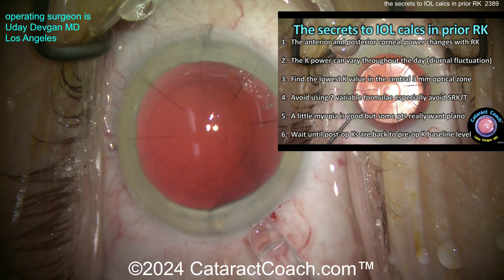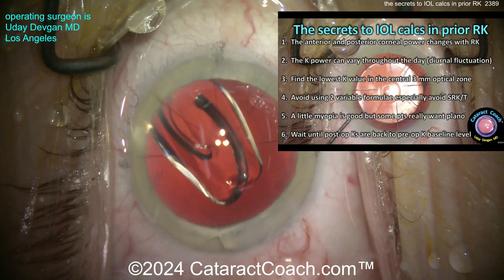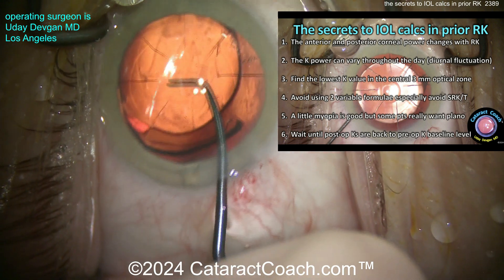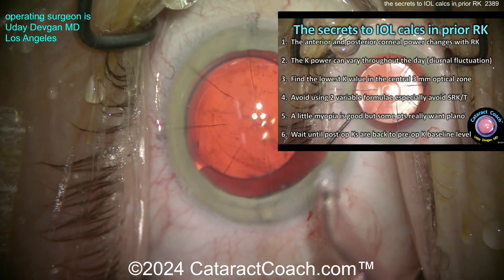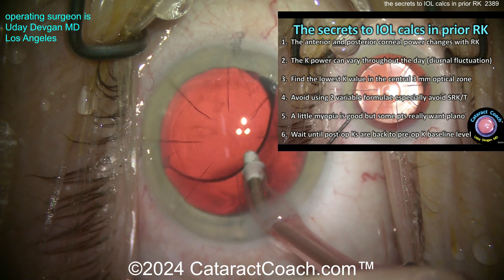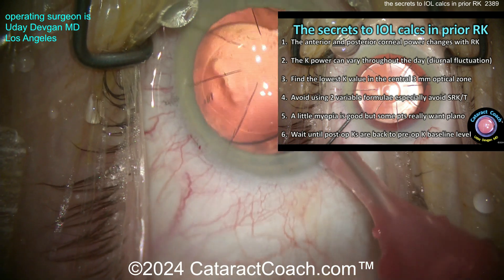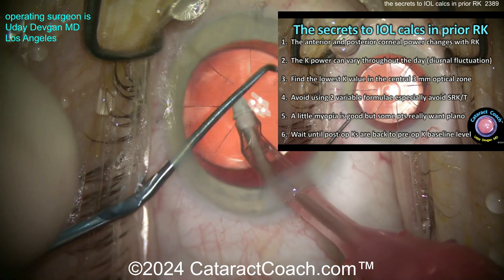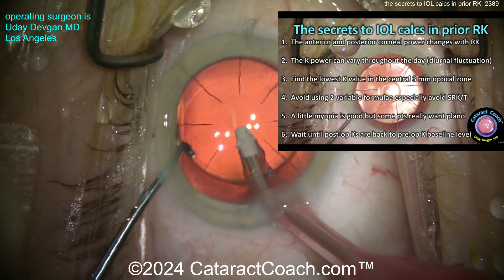Number six: wait until the post-op K values return to the pre-op K baseline level. When you do cataract surgery, even a beautiful case, you'll cause swelling of the RK cuts, flattening the central cornea further. If the pre-op K was 36, on post-op day one it may be 34, and the patient may refract at plus two — that's okay. Wait until the post-op K returns to the pre-op value of 36, and the patient will be back to plano. It may take a few weeks or even a month or two. At post-op visits, check the K value carefully to track progress back to baseline.